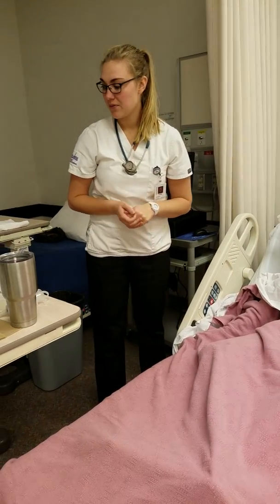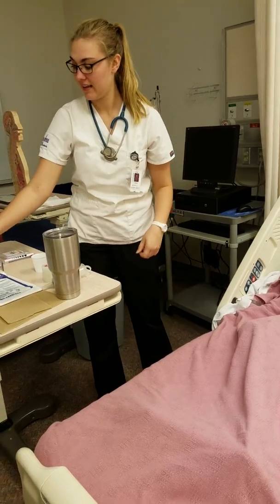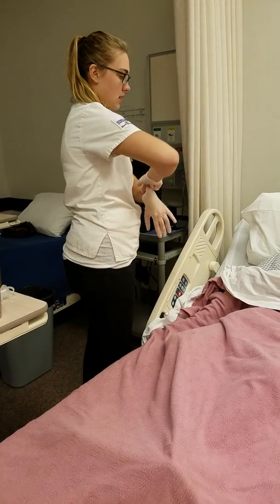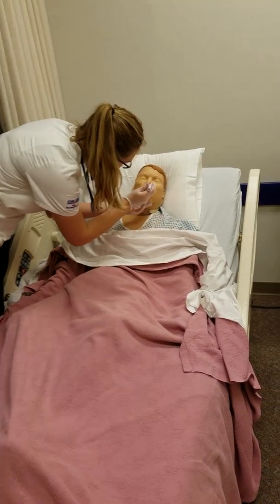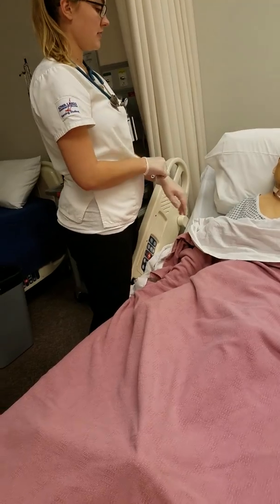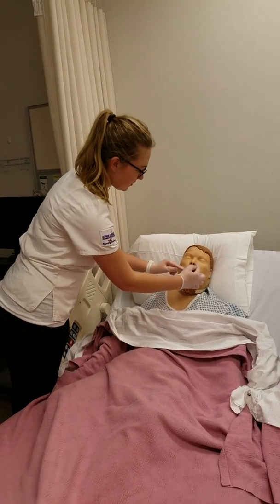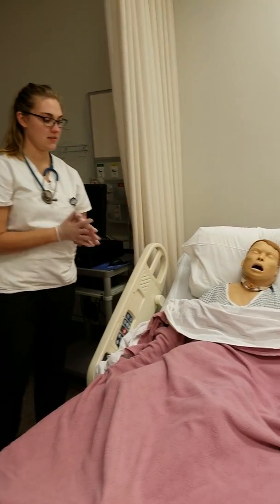Okay. And so now I'm going to place my gloves on. I'm going to begin my assessment now, okay? Some inflammation in your left nostril. Is that where you had your last NG tube? Yeah, okay, that's what I thought. So I'm probably going to end up using the right one. Just breathe normally so I can determine airflow. Okay, your right one does have a better airflow, so that is the one I'm going to use.